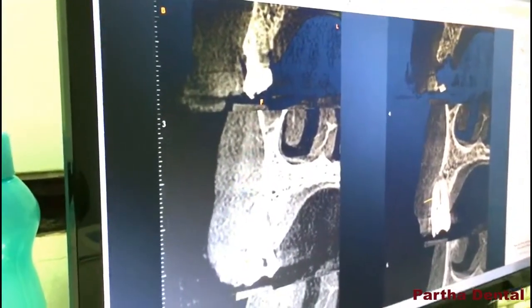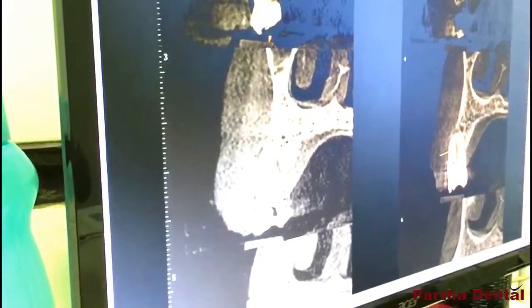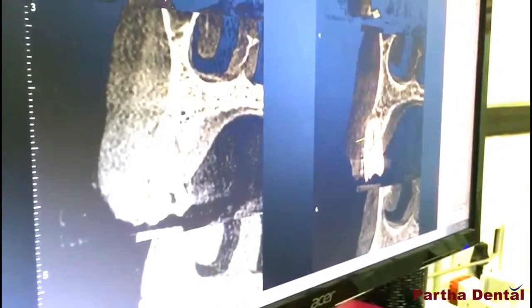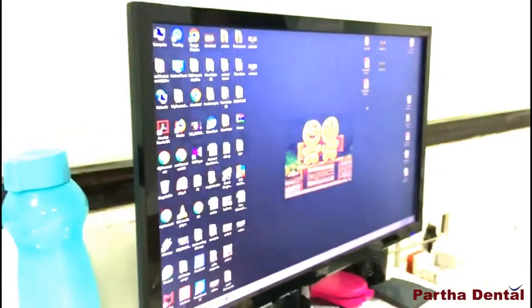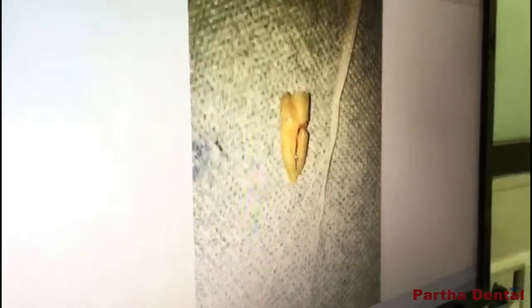The patient is presenting with the same complaint. We don't need to fix this tooth — we end this procedure. This is how it is split. Dr. Sophia, oral surgeon and implantologist, identified that the fracture line runs through the root. The root is split, that is why the patient is in pain. In this case, we will proceed to remove the tooth and place an implant.